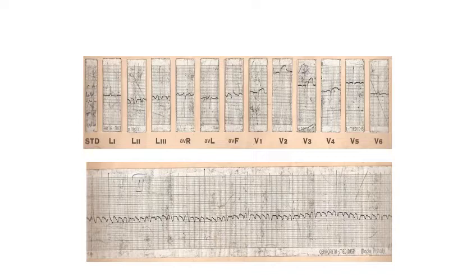Fixed block also, sir? RR interval is fixed? No, the RR interval is varying. So this patient has varying conduction. He has got 3:1, 4:1 conduction. So, sir, in the exam we have to say atrial flutter with varying block. That is not enough, it's not complete. Yes, sir, typical flutter with varying block. Yes.